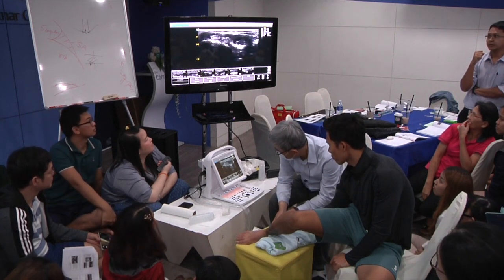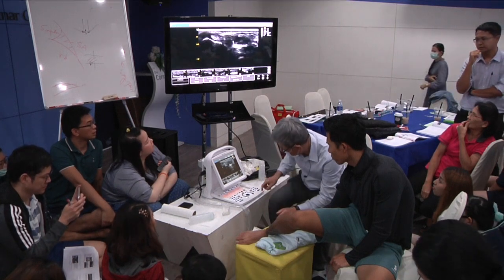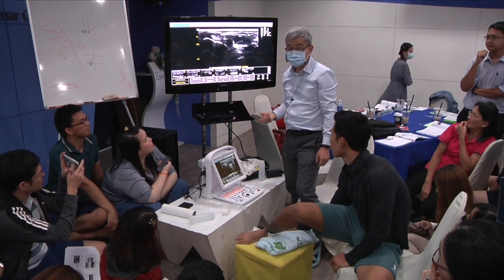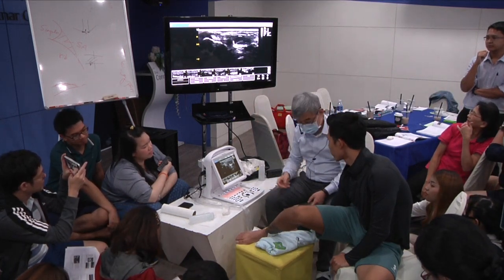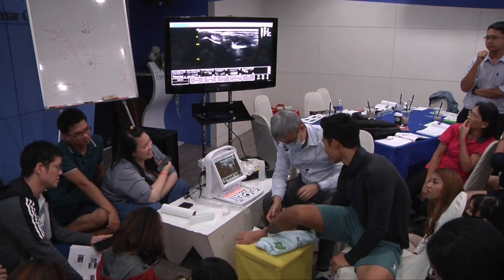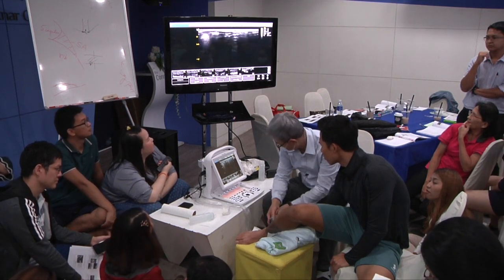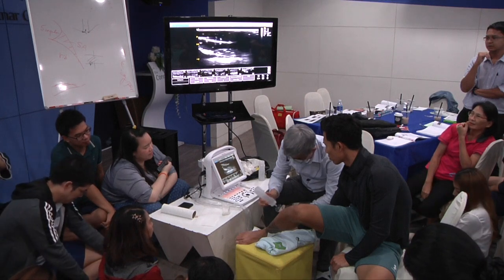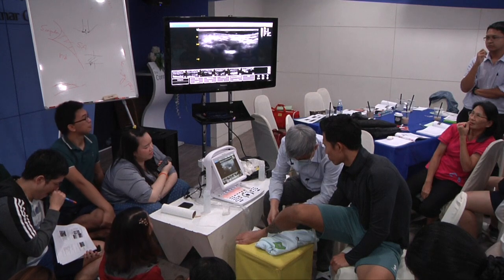So bright. Not difficult at all, right? Okay, which one do you want? Next. Okay. Hold it.